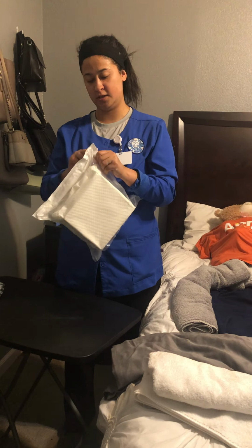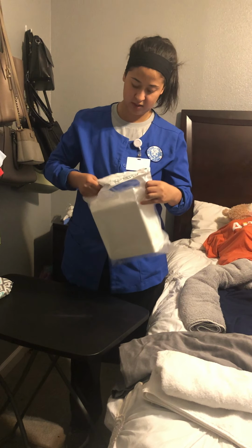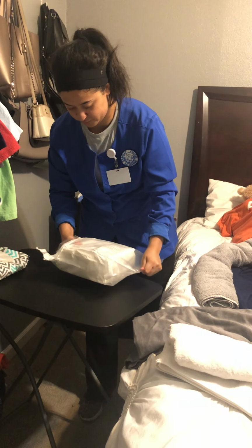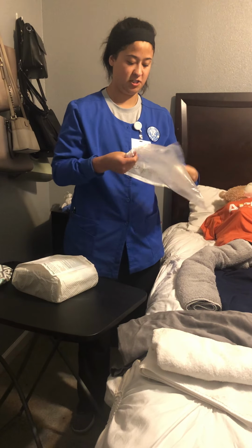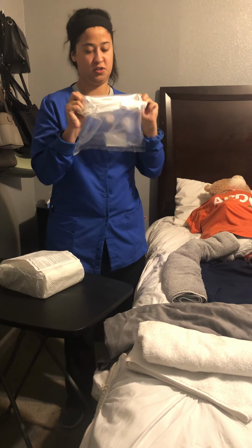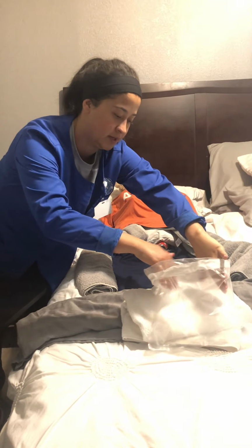So I'm going to then open my catheter kit, and I'm going to remove it, and once I remove it, it is not sterile. I'm going to use this as a trash bag so my hands don't fall below my waist and remain in the sterile field.